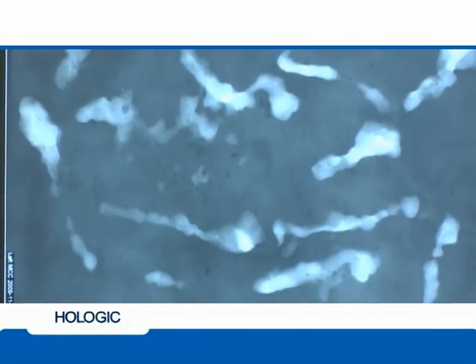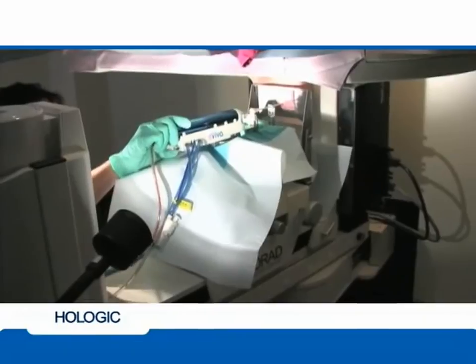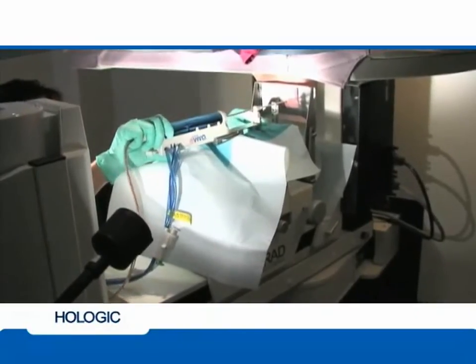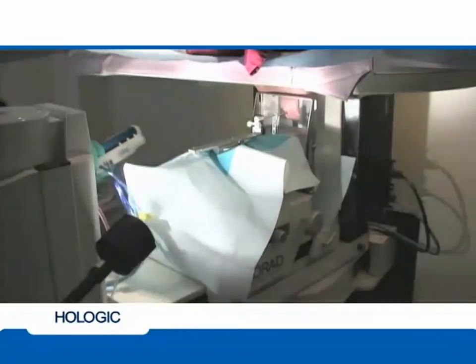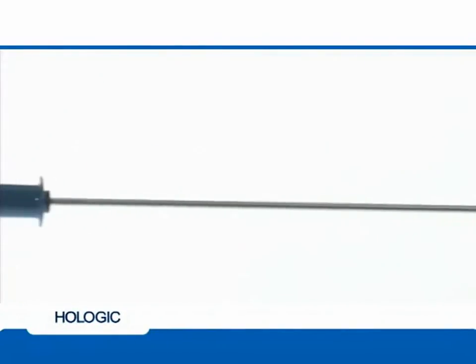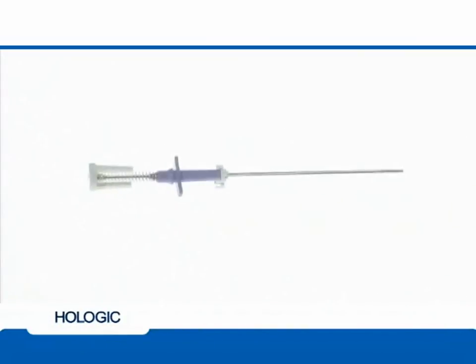When you have verification that the samples have been successfully retrieved, you may remove the device from the adapter by lifting up on the back latch and sliding the device back, leaving the introducer in the breast. You are ready to begin marking the biopsy site by placing a biopsy site identifier in the biopsy cavity.